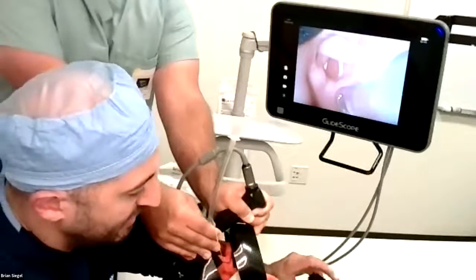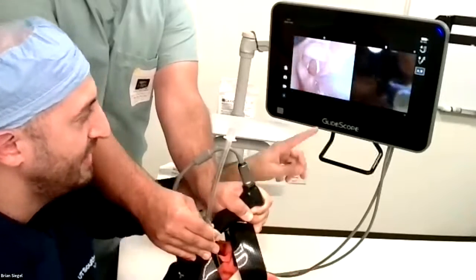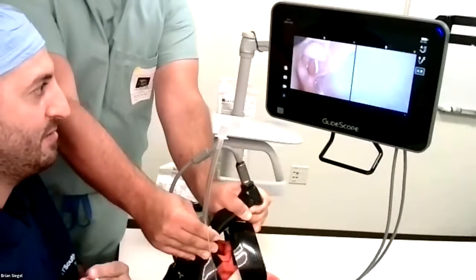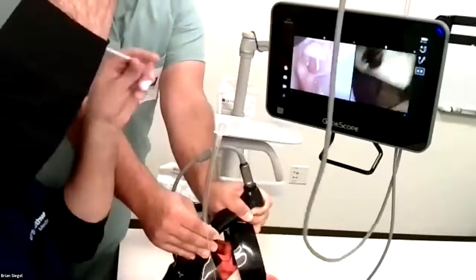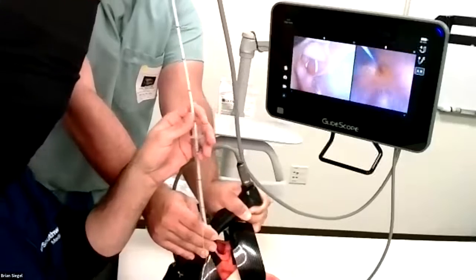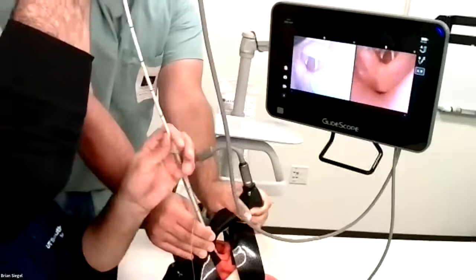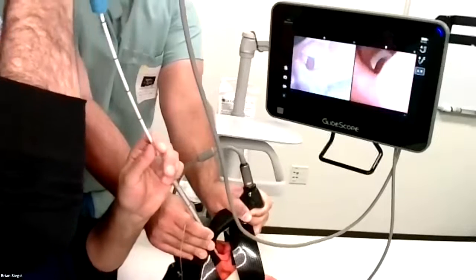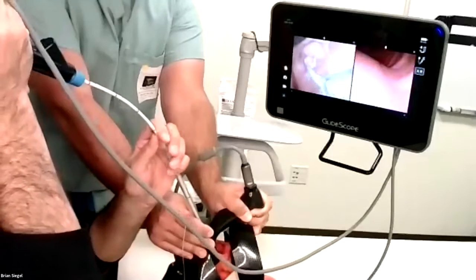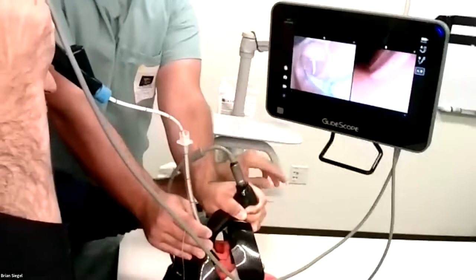Now I'm going to take my disposable bronchoscope here. Once I plug it in, I have a great split-screen image, and I'm going to insert it through the tube. Now I'm not looking at the bronchoscope — I don't care what that's showing me. I want to look at the video laryngoscope side, and I'm going to guide my scope right through the cords. I'm looking with the video laryngoscope; I don't care what the bronchoscope is showing me right now.